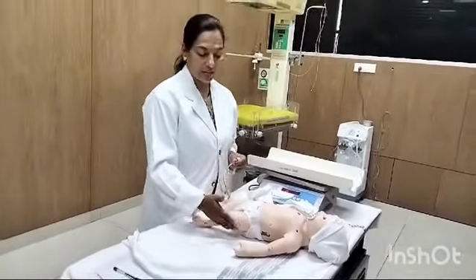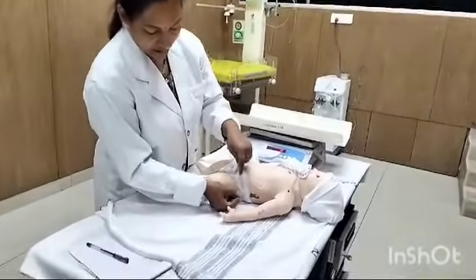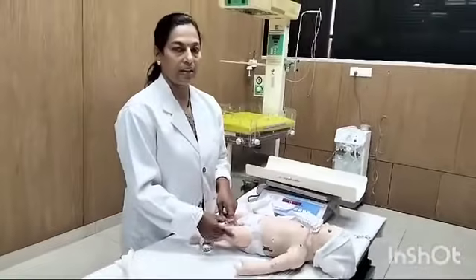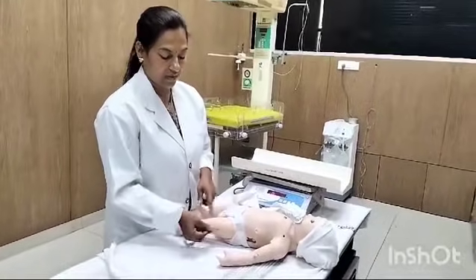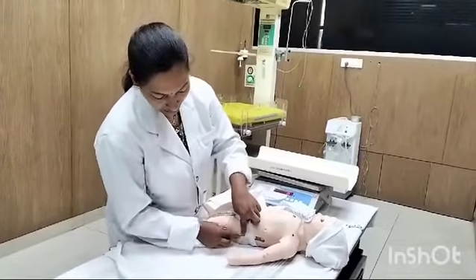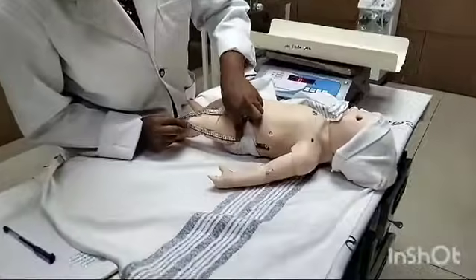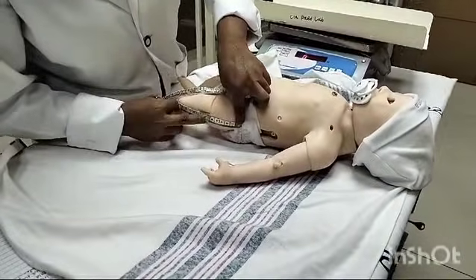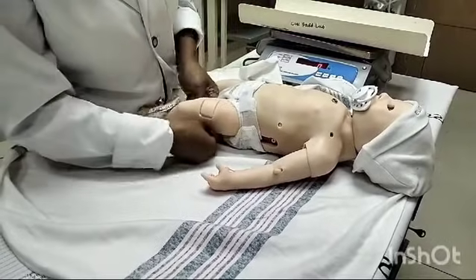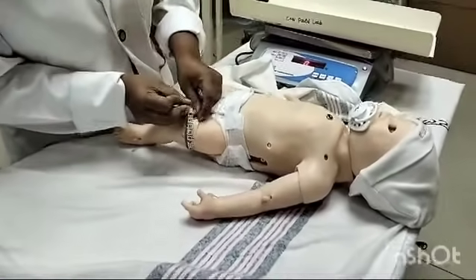In the same way, we need to take the mid-thigh circumference. If you know the midpoint, you can take the mid-thigh circumference directly. But if you don't know, measure from the greater trochanter to the knee joint, find the midpoint, and over that midpoint, measure the mid-thigh circumference.